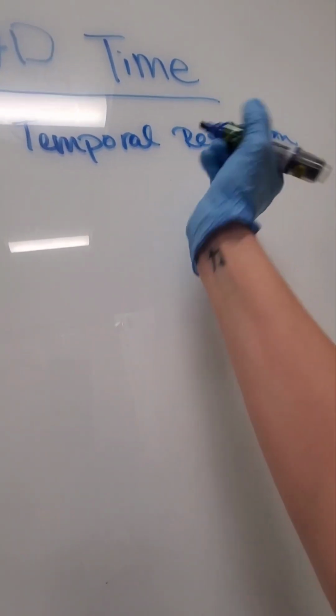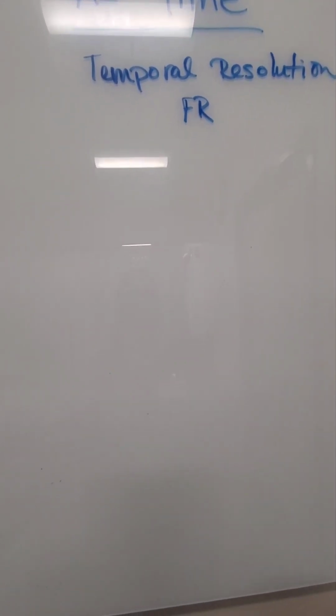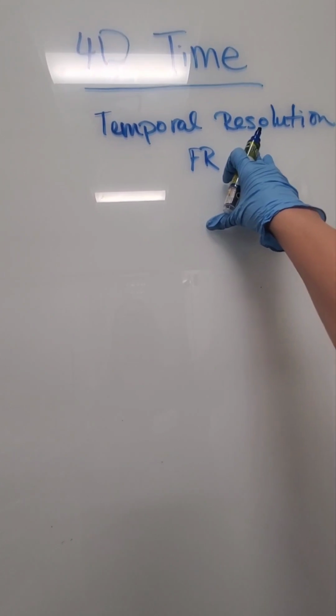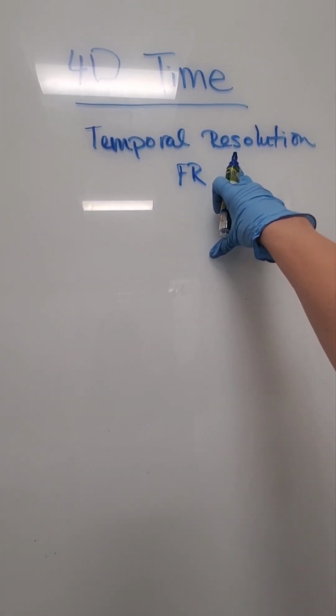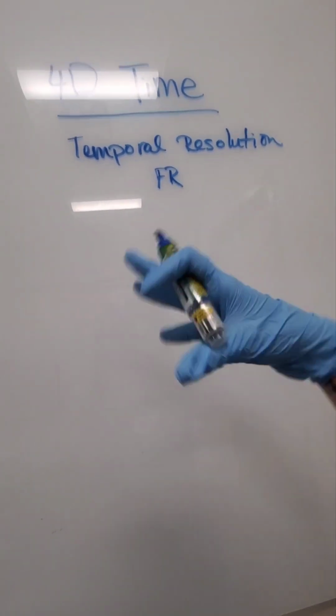How fast our frame rate is, how fast that frame time, how quickly can our machine build that whole frame so we can actually see things in real time? Or is it starting to glitch out and we're lagging and things are slowed down and it looks blurry across time? So 3 dimensions are spatial resolutions.